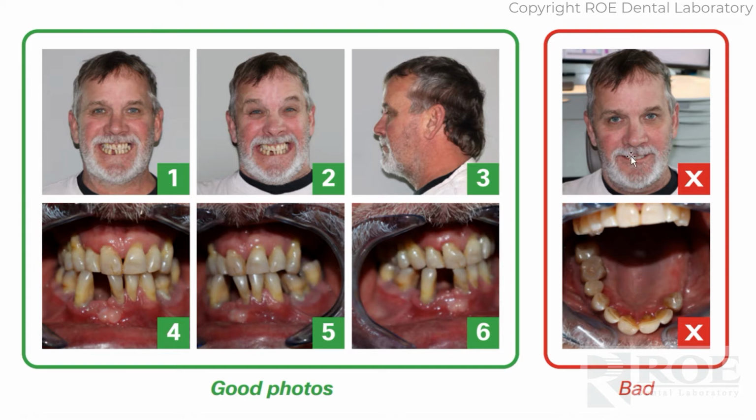And certainly we don't want photos where a patient has more of a sedate smile, or you can see in this picture the nose is tipped down, the patient's looking a little bit to his right. We want the photo straight on, try to get the lens right in the middle of the nose, and a big smile for that photograph.